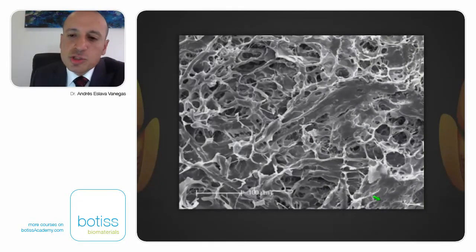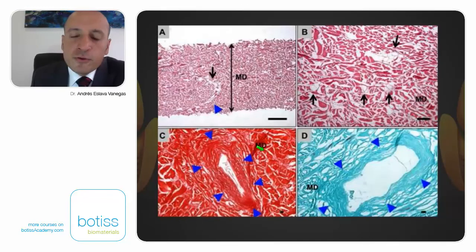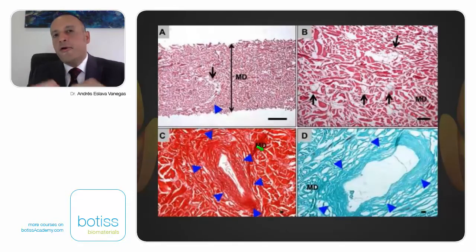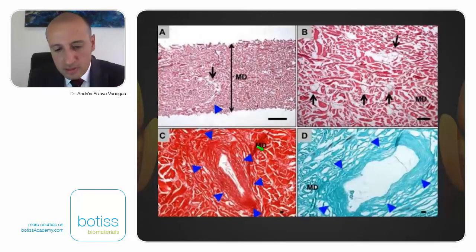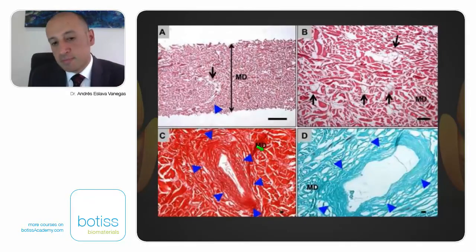And you can see here the 3D structure of this dermal graft. You can see the channels and the pores, and we want the new tissue, the new fibroblasts, to grow into this mucosal graft, or this dermal graft, and replace all this structure. Here is a beautiful photograph of the histology of dermal grafts when it's prepared. We want this dermal tissue to have all the cells and the follicular hair removed, but we need these channels that you can see here, the microvessels inside the dermal graft, because we want the new microvessels to grow into this mucosal graft.